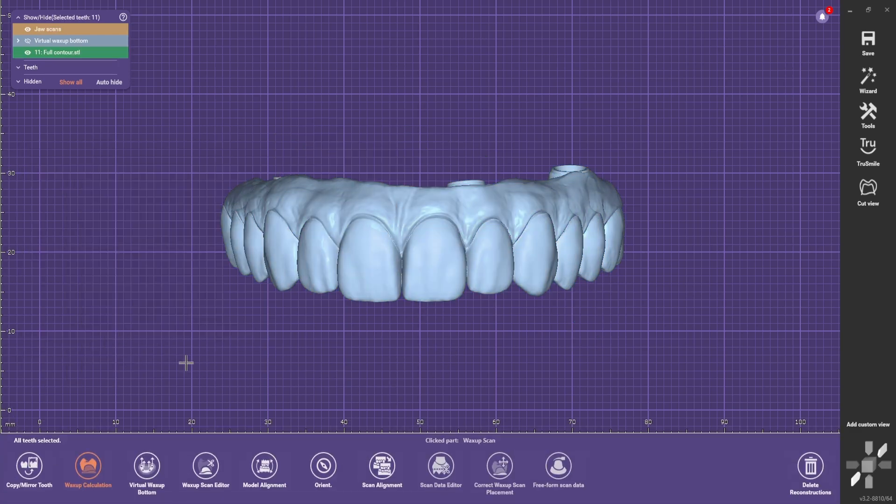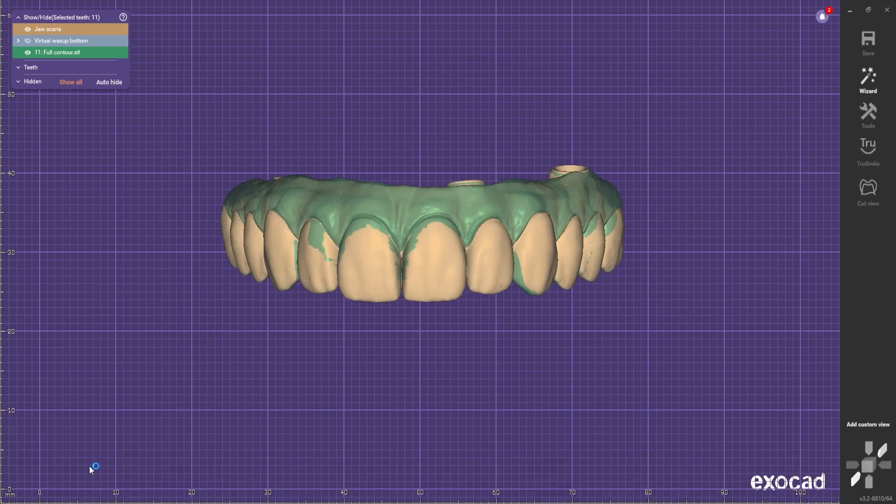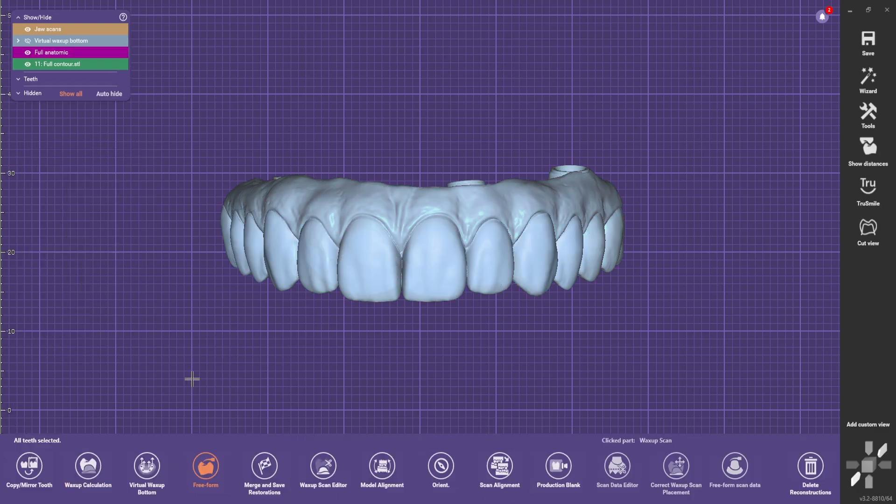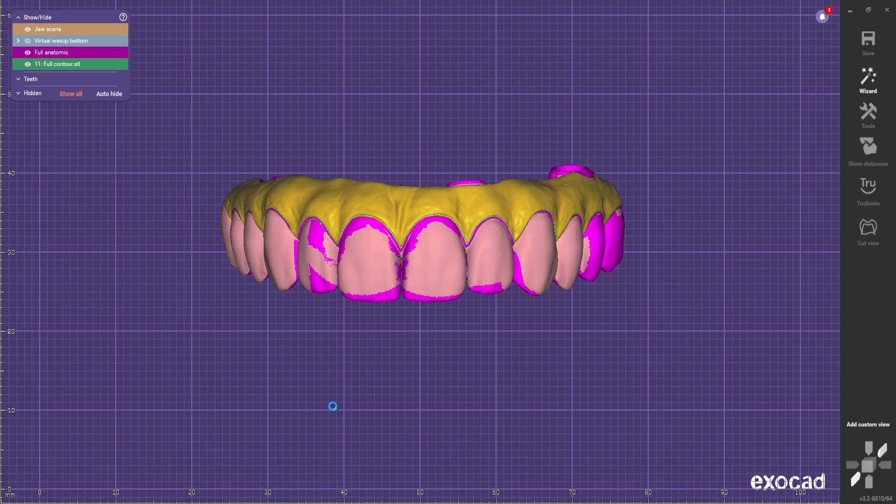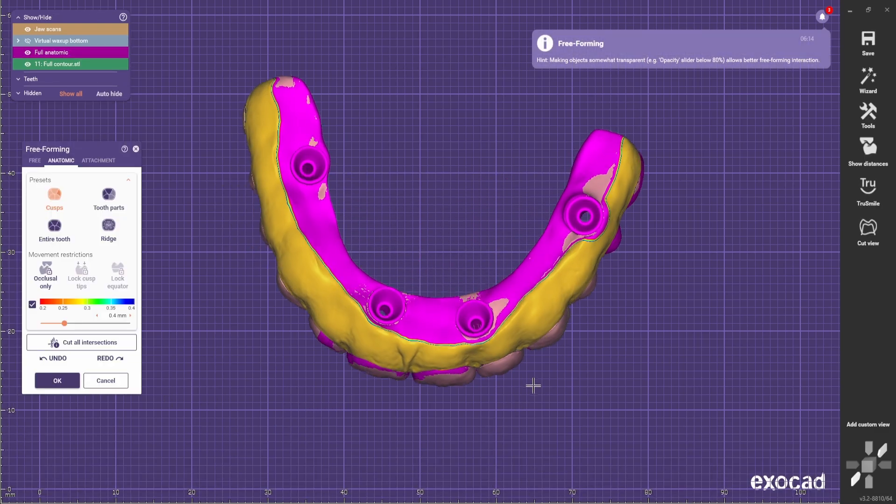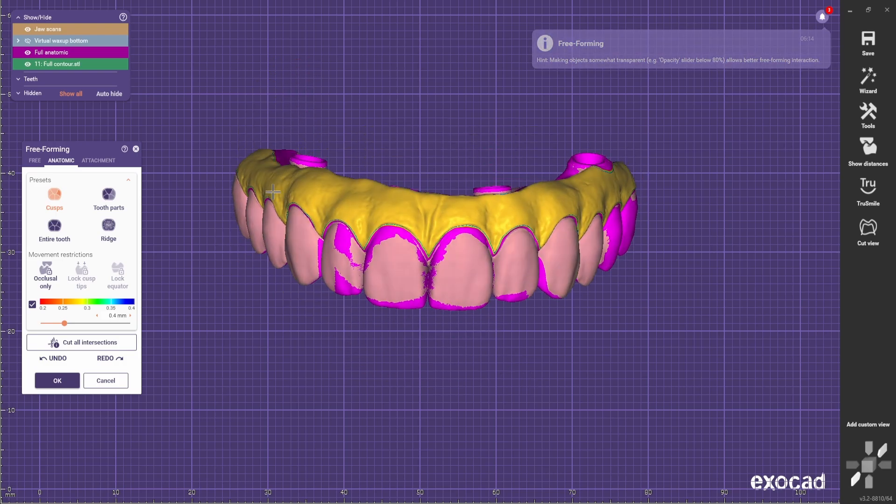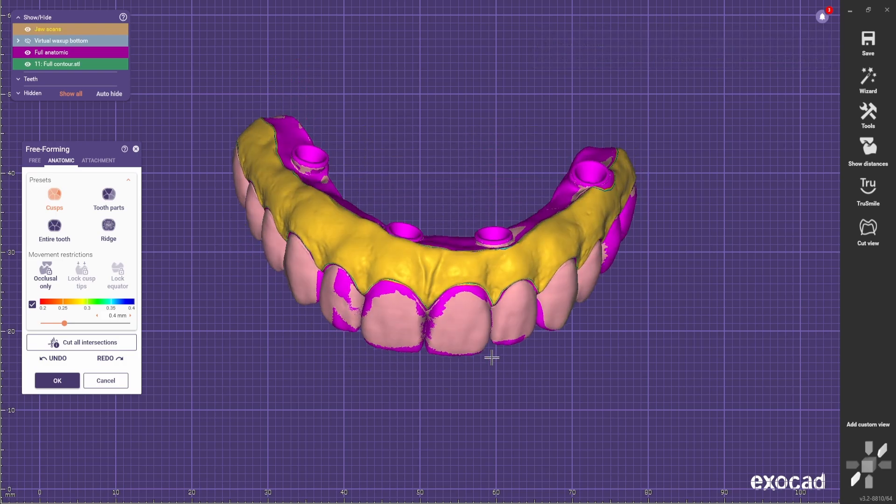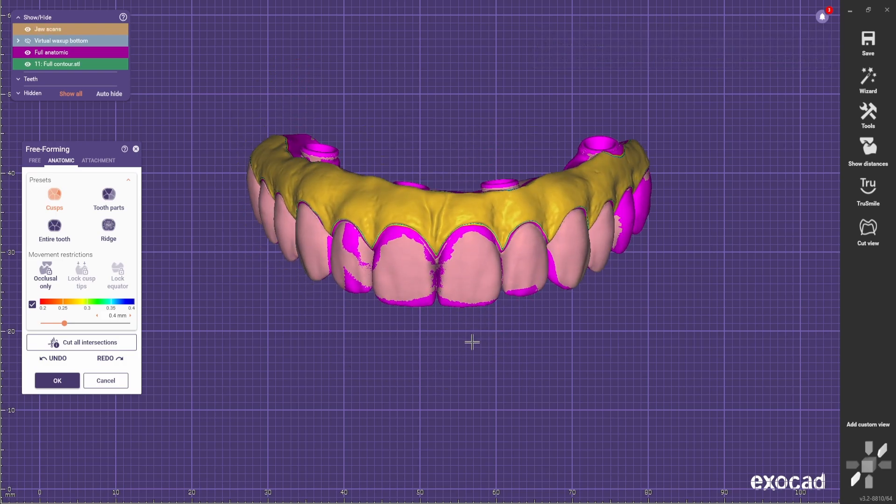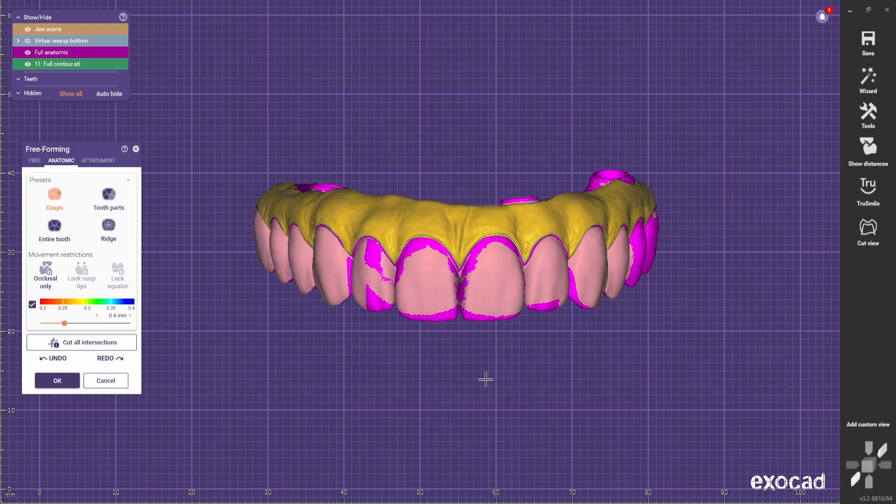Now do the Waxup calculation. And then go to free-forming. You're gonna have something like this. So basically what you have in yellow is gonna be separated from the rest.